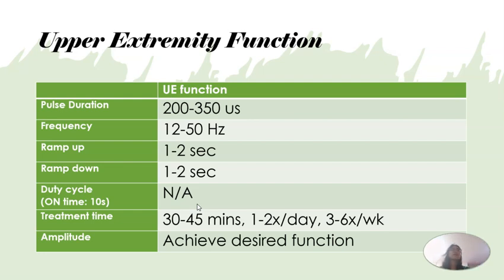So, let's say, si patient, di naman siya ganun ka-disabled. Let's say, ang pag-release niya would take approximately 2 seconds lang. Okay? 2 seconds lang ang kailangan niya to release. So, that's going to be ang on time ninyo, 6 seconds.